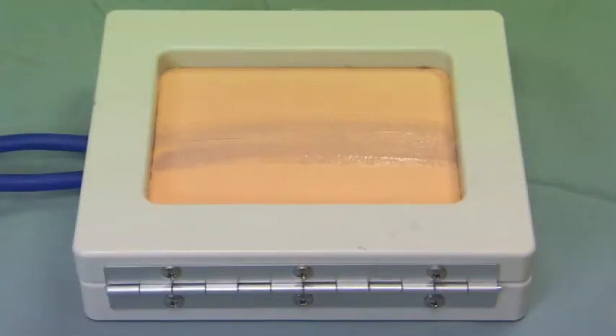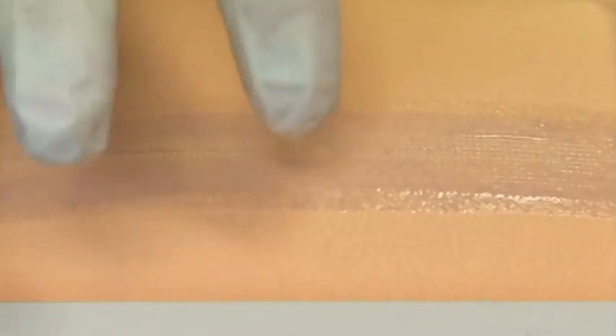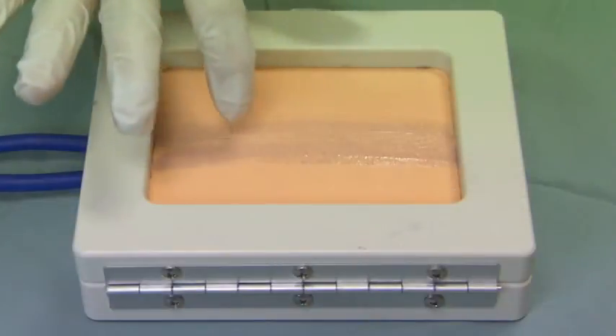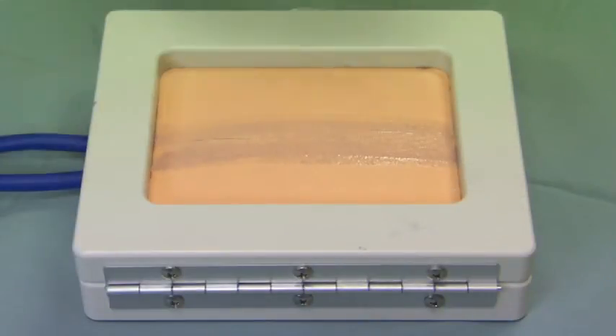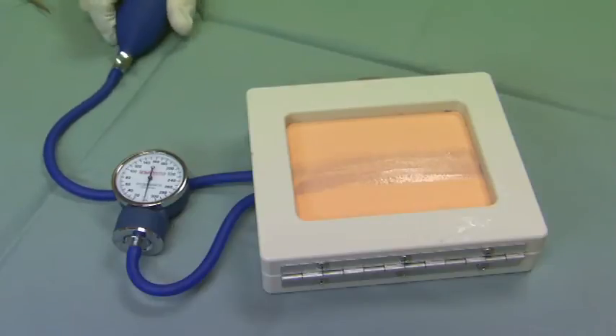The adhesive takes about 30 seconds to set, and you can judge that by how tacky it is. I'll just touch along here — it's slightly tacky but not liquid. Now it's safe to put dressings on top. We'll test the strength of the closure by applying pressure to the wound.